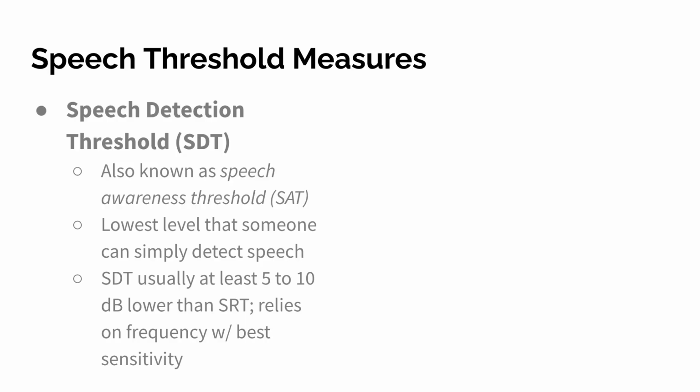I had a patient the other day whose speech detection threshold was much better than his pure tone, his best frequency that I tested. It happened that his best frequency was 125 hertz, so I tested 125 hertz in that case, and then it matched up just fine. He had kind of a corner audiogram.